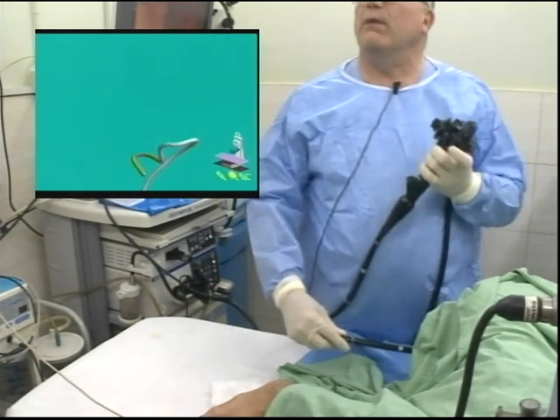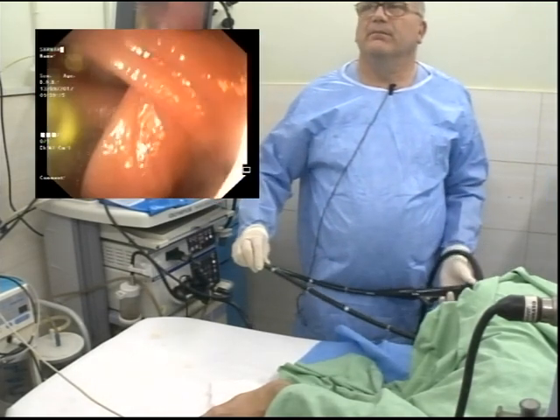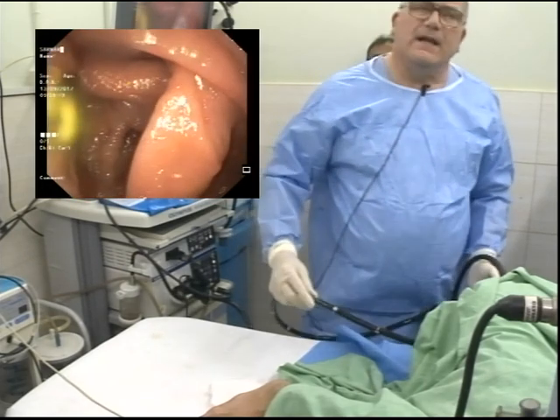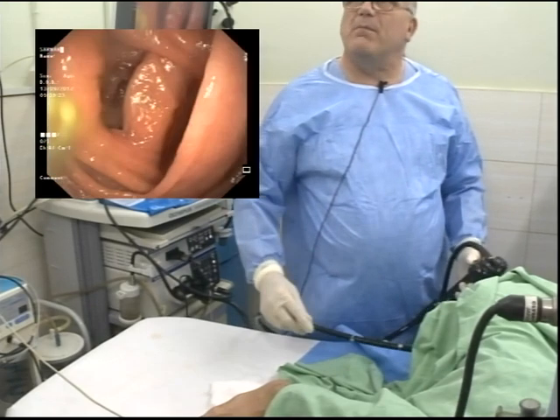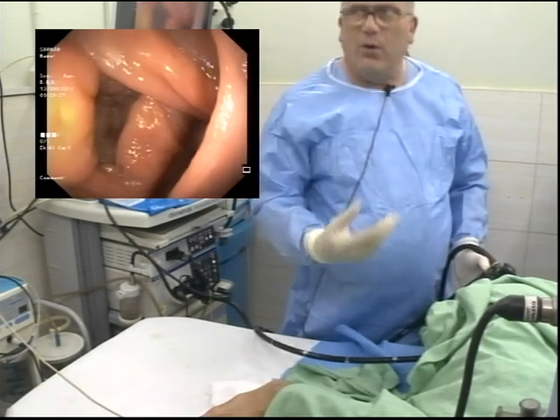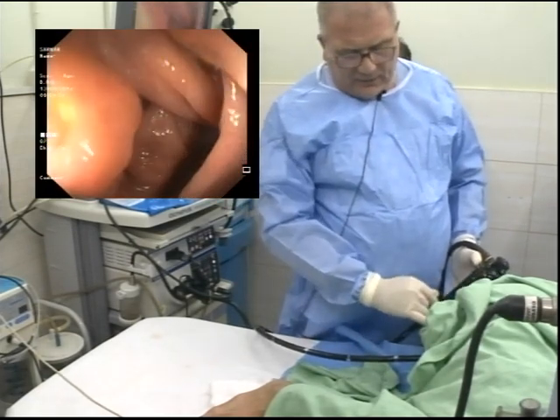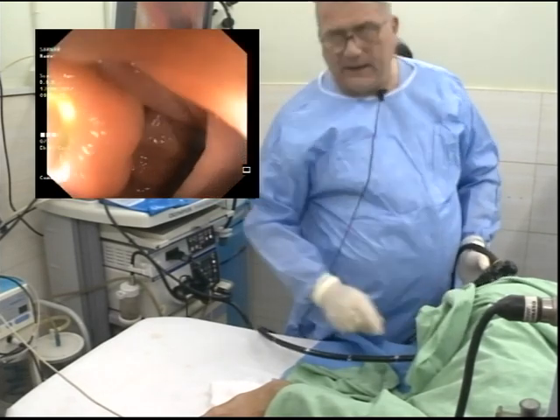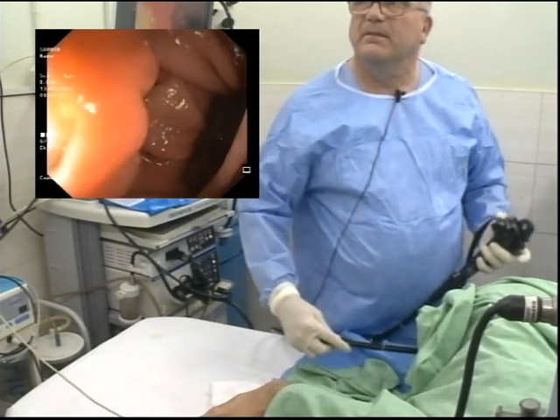We're roughly now coming to where we want to be. Where's that in front of us? So we've got a thing to the left. Now I always say to people, we've got something in front of us, it may or may not be where we want to be. Technically, that's the ileocecal valve on the left, but if we look at this person's anus, which I'm not going to allow you to see, I can guarantee you this scope is at 55 centimetres.